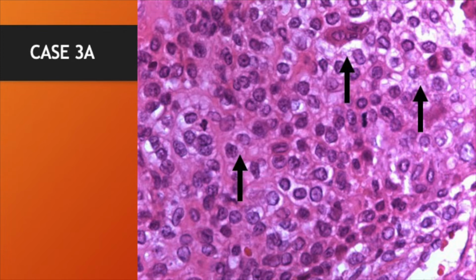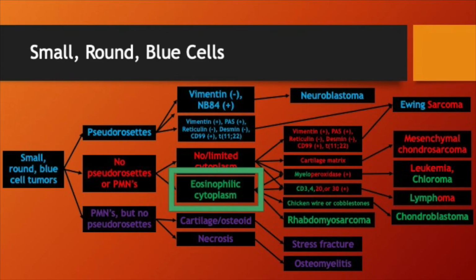It's really hard to tell what's going on, but there is some eosinophilic cytoplasm within these cells. It's really tough to see, and a lot of them almost look like clear cells, but much of that is artifact as a result of the drying process when you're plating and staining these. That's hard to know and hard to recognize, but you have to look at these areas that I'm pointing to where we do have some eosinophilic cytoplasm. So it's easy to miss that, easy to go wrong here, but it's there.